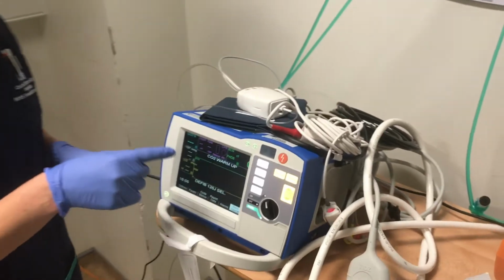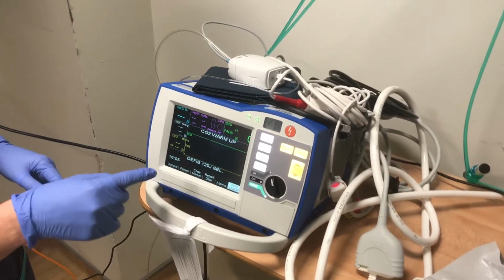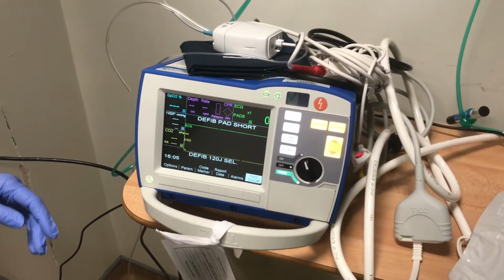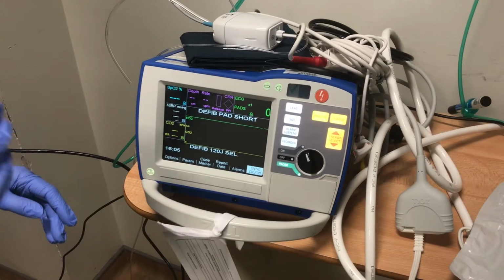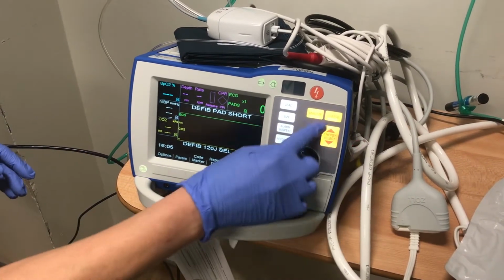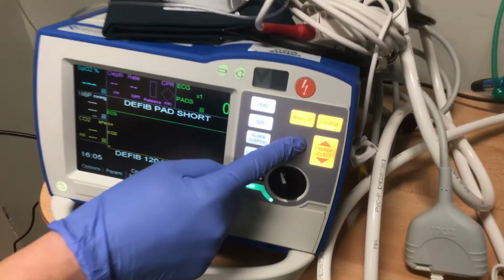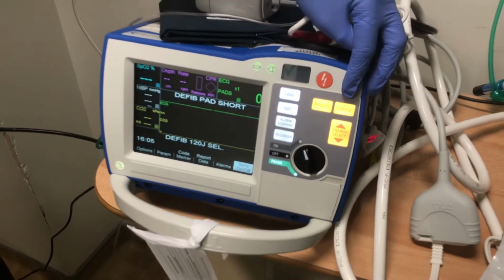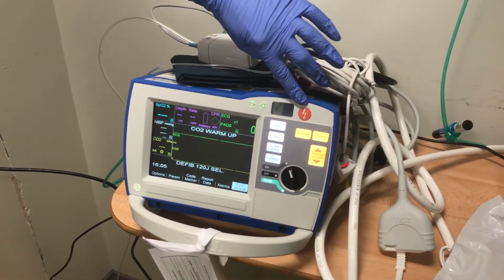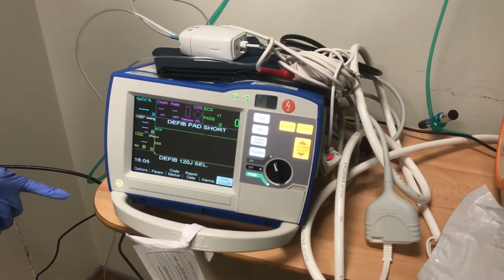This defib defaults into a 120 joule for the first manual shock. It will automatically increase after every shock, up to 3 shocks, so it'll go 120, 150, 200. If you do want to select the energy yourself, you can do that using the energy select button. To charge the defib, you press charge. To deliver the shock, it is this button here that will flash when the charge is at the right joulage.